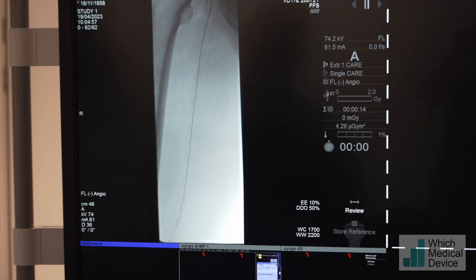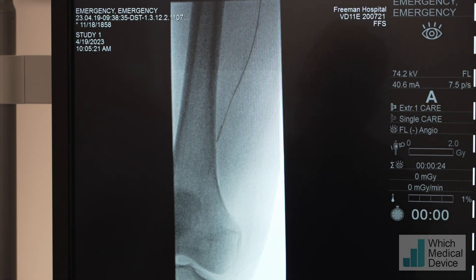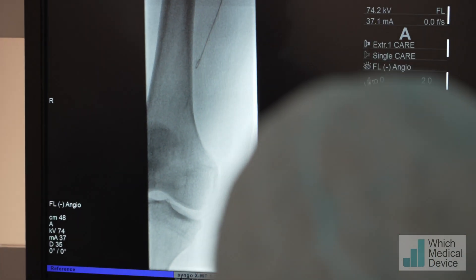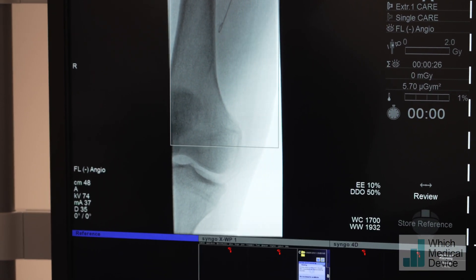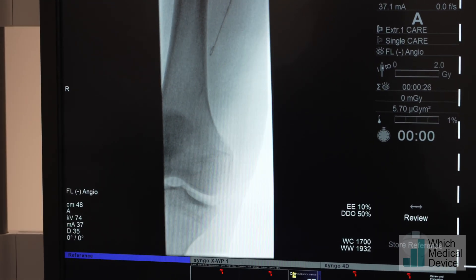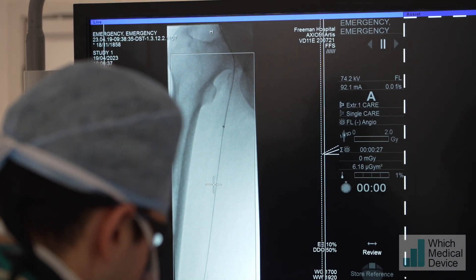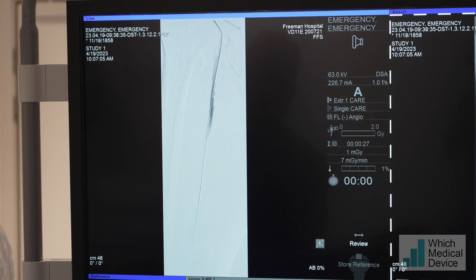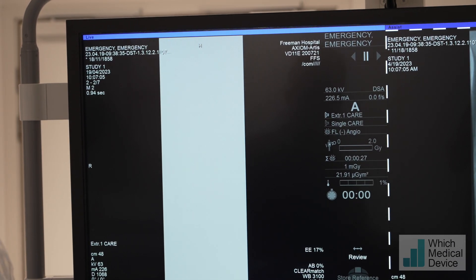Can we go further down please? Here we're reaching a point where the J is not advancing freely, and that's expected because we think there may be an occlusion. So let's sheath it - we're using a 5 French sheath in this case. We're removing the Seldinger needle and advancing the sheath. You will feel a warm sensation going down the leg now - don't be alarmed, it's just contrast going down the leg.